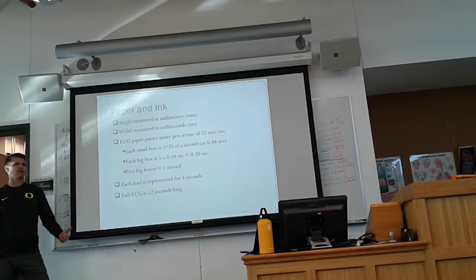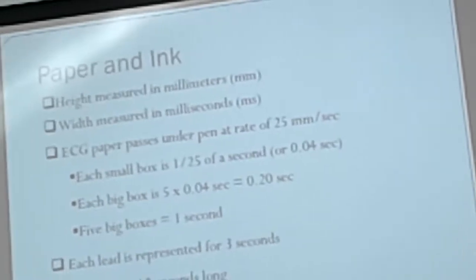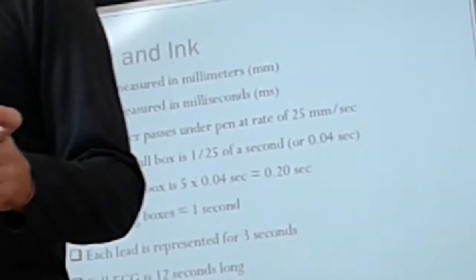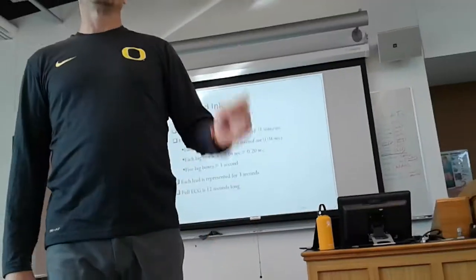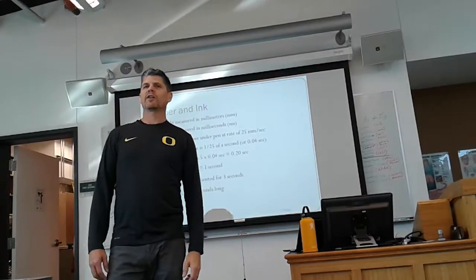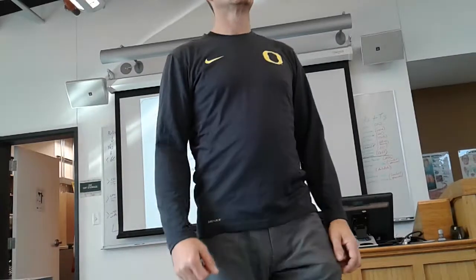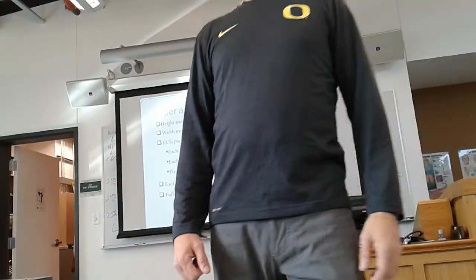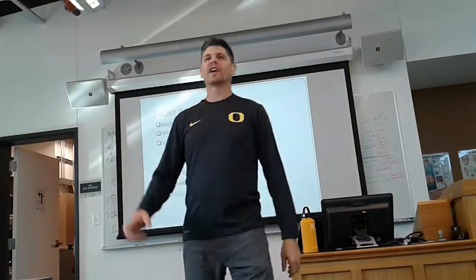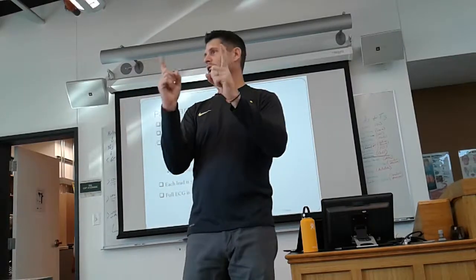There'll be times where we talk about it in seconds, and times that we talk about it in boxes. Sometimes when you're analyzing an EKG, you need to be specific on the time. Other times, you just need to know that it's a range, and so you just use boxes. For example, the PR interval has to be within what time frame? 0.12 to 0.2, right? That's our range of time.